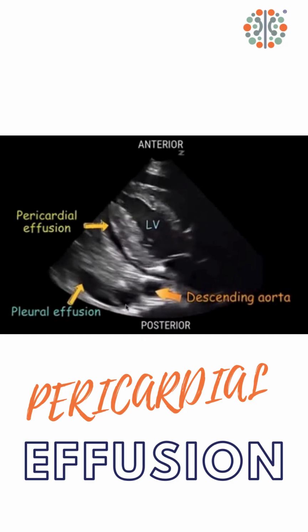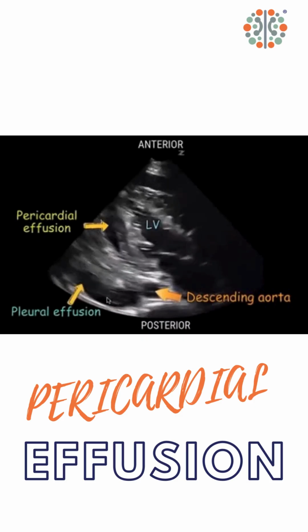Also of note in this view, some people do have a fat pad over the anterior portion of the heart. To differentiate this, the fat pad moves along with the heart and will also not track posterior to the heart, which this effusion does here.